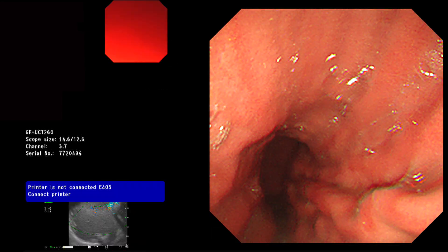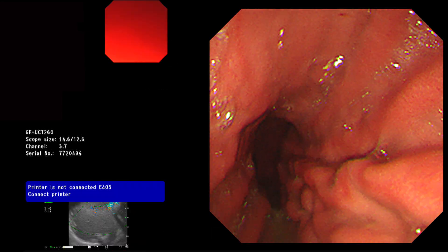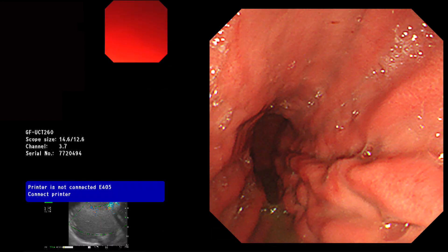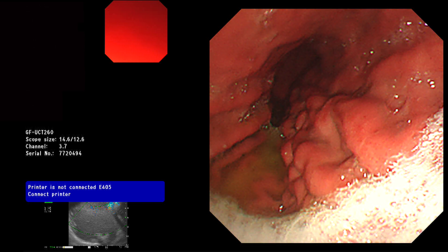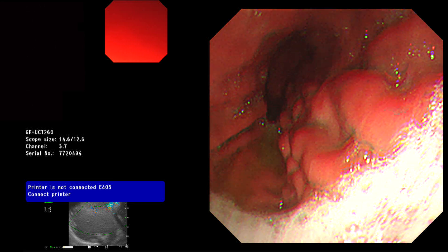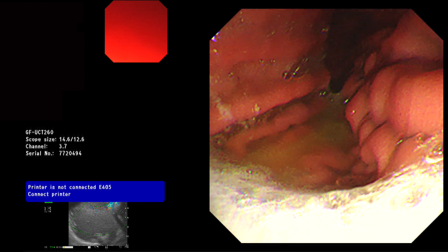The endoscopic view shows a bulge on the posterior wall of the stomach. A good site is chosen for the placement of the stent.